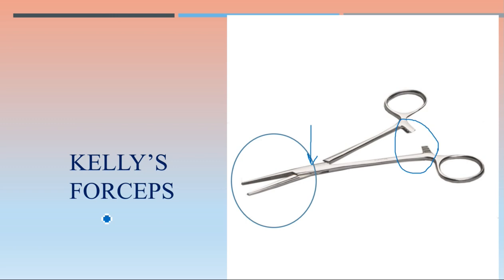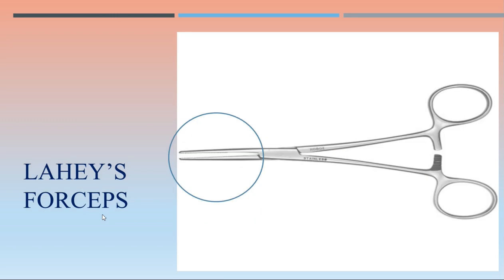Kelly's forceps is commonly known as medium artery forceps. Then Lahey's forceps — a long one. Lahey's forceps again has serrations, a long distal end, the joint is here, and the lock is present.